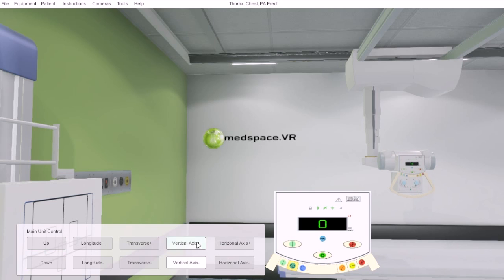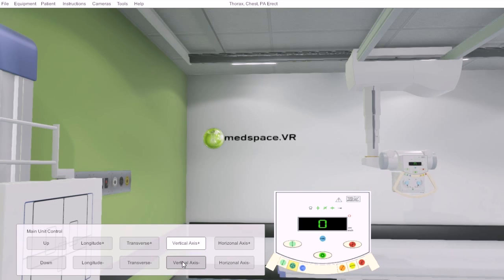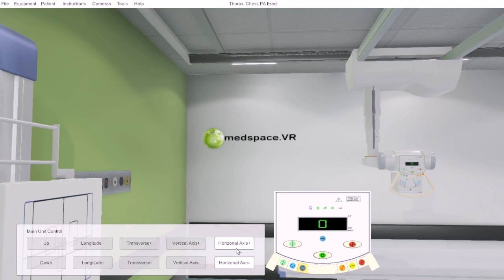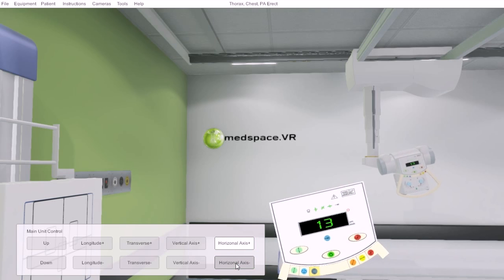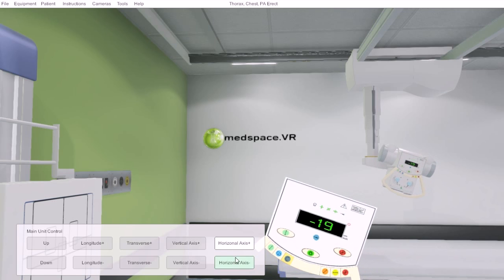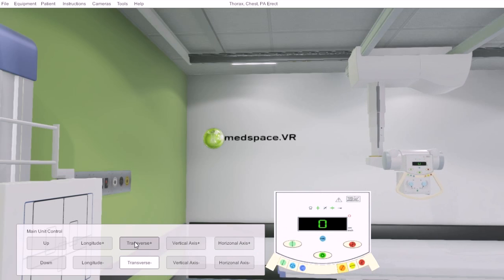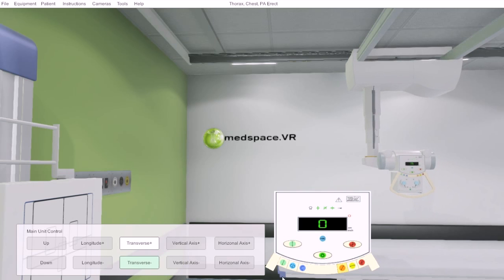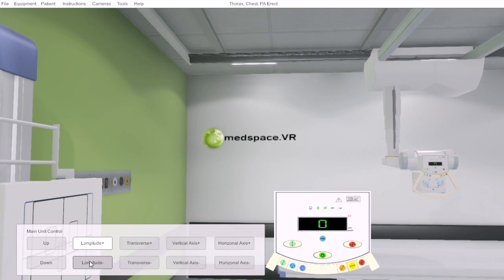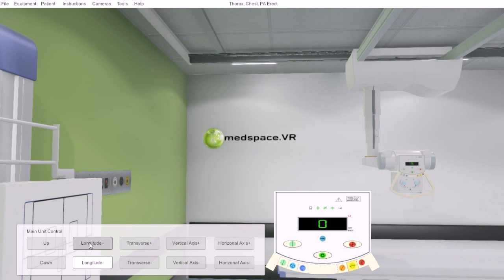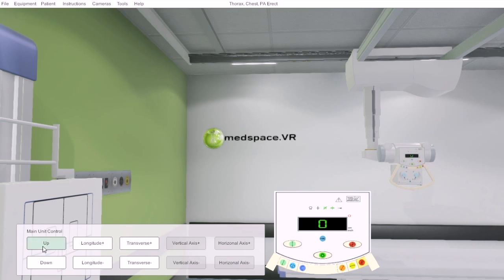We have our vertical axis where the machine can be twisted either way on its vertical axis. We have its horizontal angulation button or lock, so we can angle the tube horizontally according to the procedure we wish to do. We have our transverse button so the tube can be moved closer to us or further away. Our longitudinal button to move the tube along the ceiling longitudinally, and then our all-lock button allows us to interact with the vertical movement and the transverse movement.